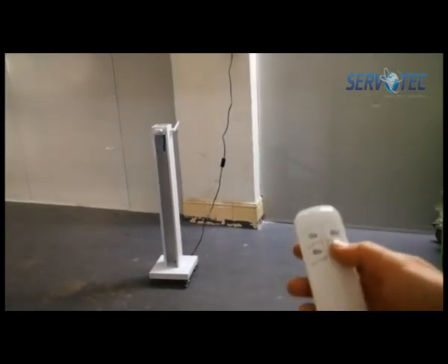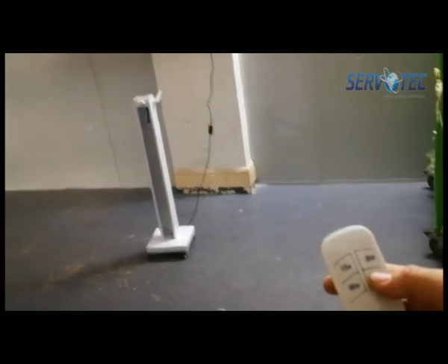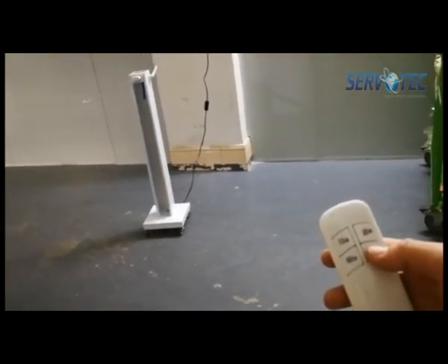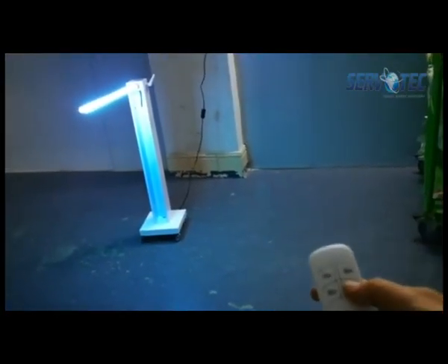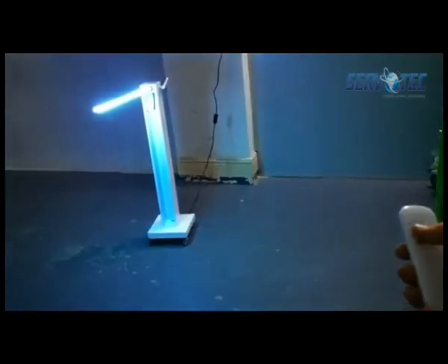That's how this whole Servotec UV disinfection lamp works. As you might be observing on the screen, the moment you use the remote, it gets turned on and starts glowing.